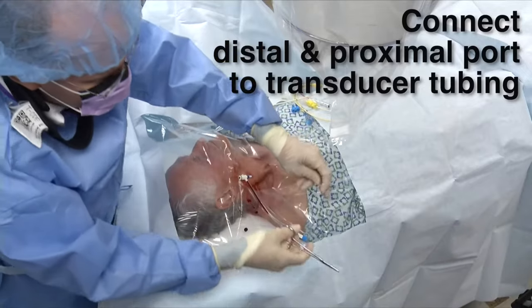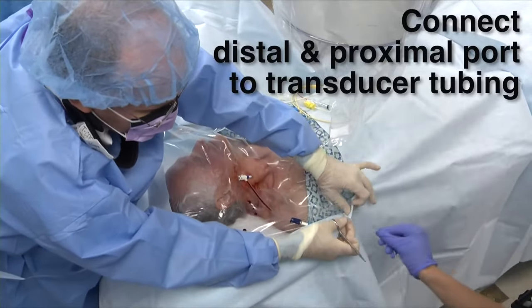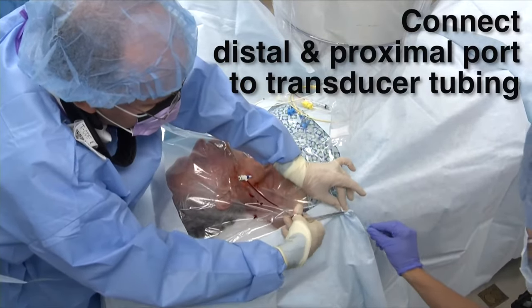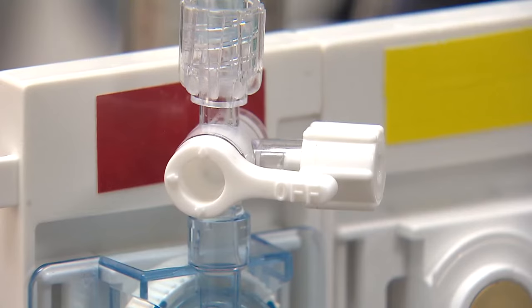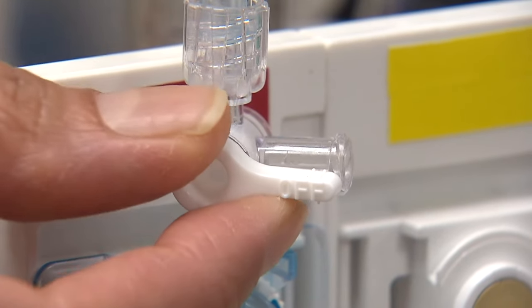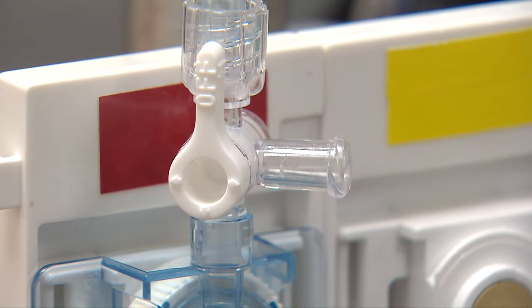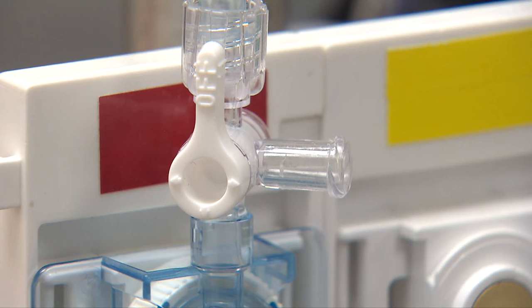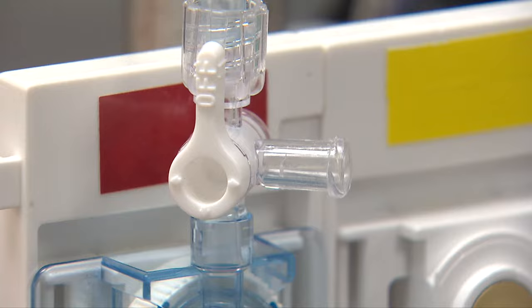Once the introducer sheath is in place, it is time to insert the pulmonary artery catheter. Prior to actual insertion, the sterile distal and proximal ports of the PA catheter must be connected to the non-sterile transducer tubing. All transducers should be zeroed by opening the side port of the three-way stopcock on the transducer and rotating the valve so the transducer is exposed to air. Zero the transducer on the monitor, close the side port, and turn the valve so the transducer is re-exposed to the catheter tubing.